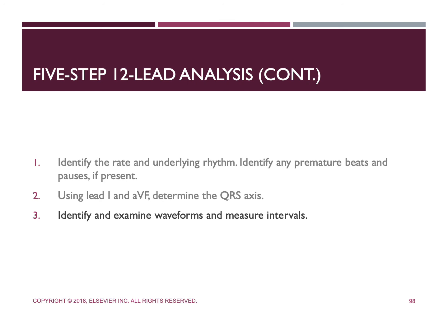Next, what you're going to want to do is examine each lead. What you want to do is select one good representative waveform or complex in each lead. And then you're going to inspect each waveform, noting any changes in orientation, shape, size, or duration.